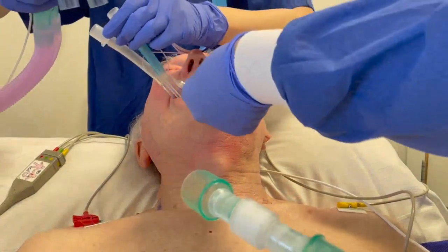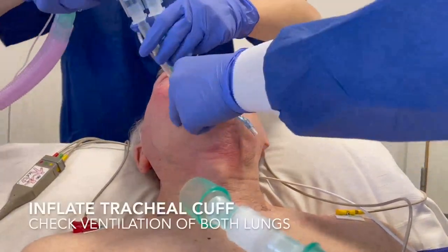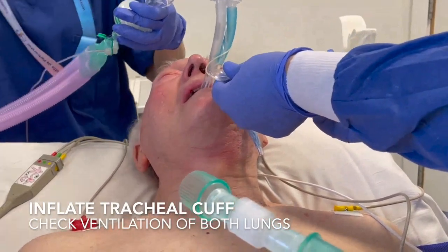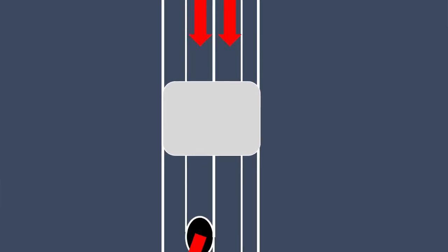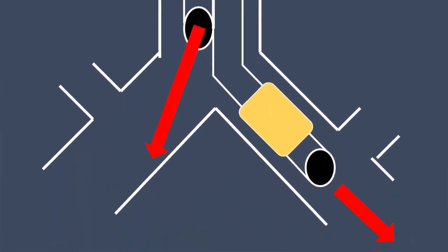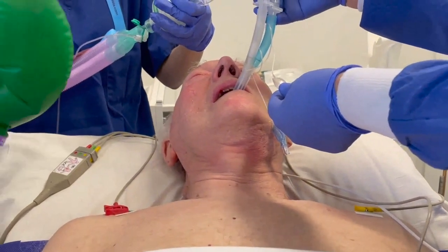After applying the connector, inflate the tracheal cuff. Both right and left lungs should inflate, and end-tidal carbon dioxide should be confirmed.